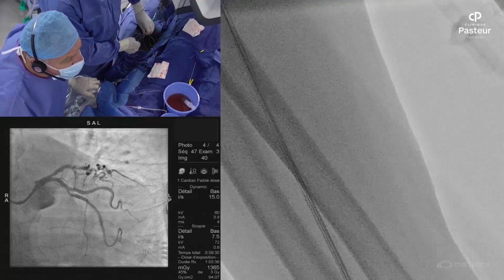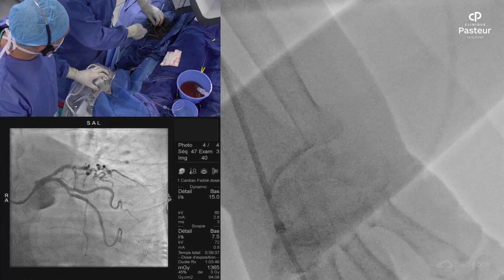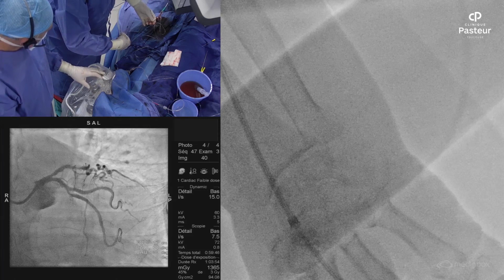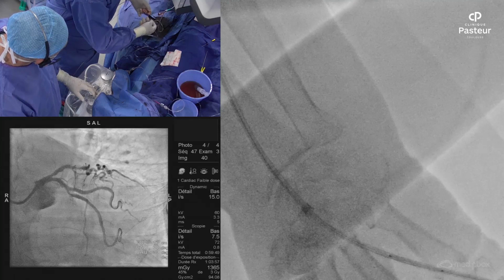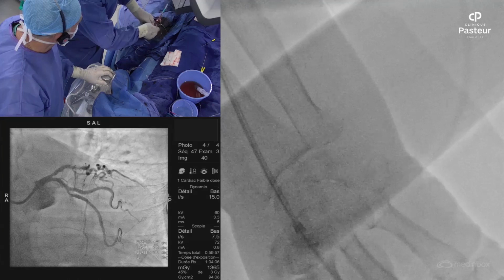And now we'll be inside the sheath, the tube. Inside the tube, okay. I continue to remove it. And I hope that I will get in the connector. Where are the wires? Yeah, but I need the two wires. Okay, here. Yeah. Okay, good. Now I pull back, open the valve.